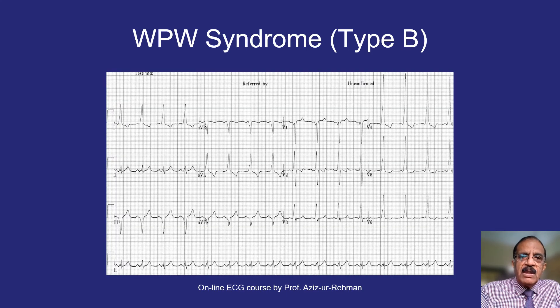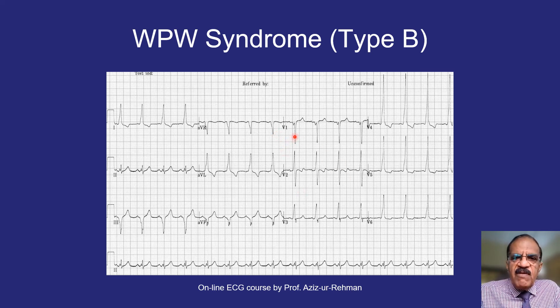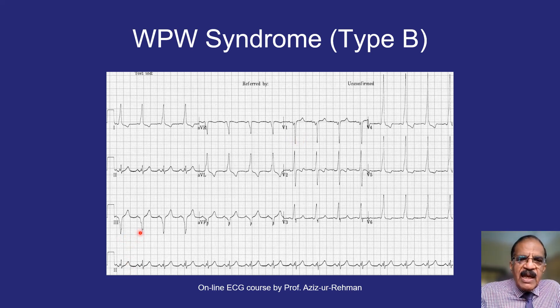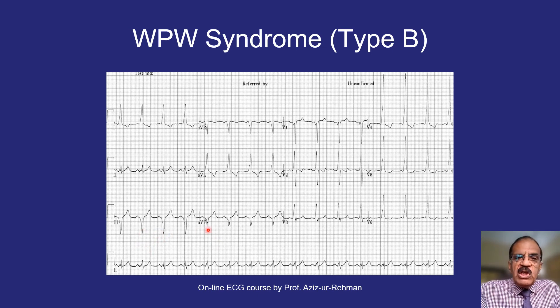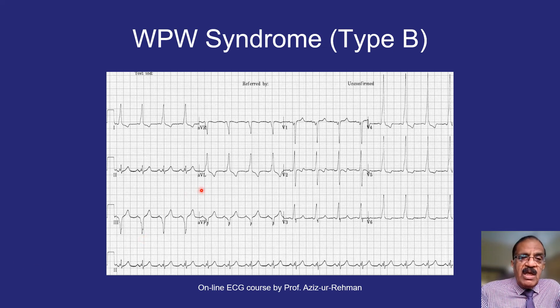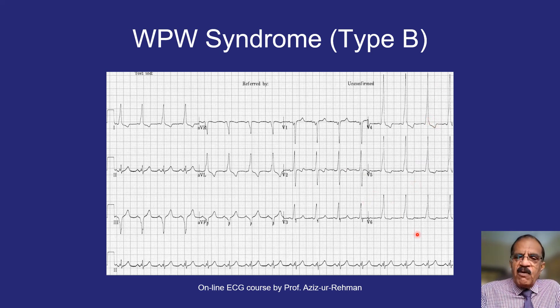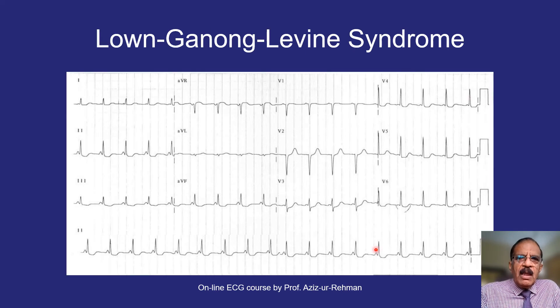This is Type B WPW, where the delta wave is inverted — it is downward in V1. You could easily confuse this complex with a QS complex. Similarly there are QS complexes in lead III and aVF, which could easily be confused with inferior wall infarction or anteroseptal infarction. Type B is very difficult and can give rise to false diagnoses. You also see hypertrophy and ischemic patterns here.